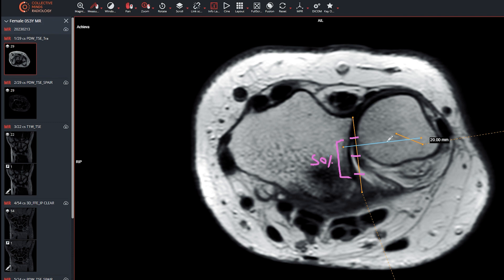In conclusion, I personally don't measure any of these things or use these methods on MRI specifically. The role of MRI is more to assess what the primary and secondary stabilizers are doing — assess the TFCC, all the ligaments and tendons, check for osteoarthritis and degenerative changes — rather than trying to find instability on a static image. If you really want specific imaging for instability, articles recommend dynamic ultrasound — where you can compare the other side — or bilateral CT, or even MR with maximum supination and maximum pronation. The advantage is having the contralateral healthy side as comparison to understand baseline laxity, and any side difference represents the pathologic instability component.